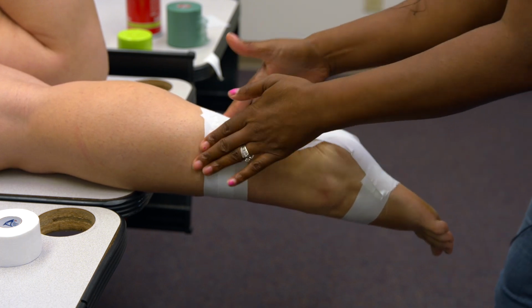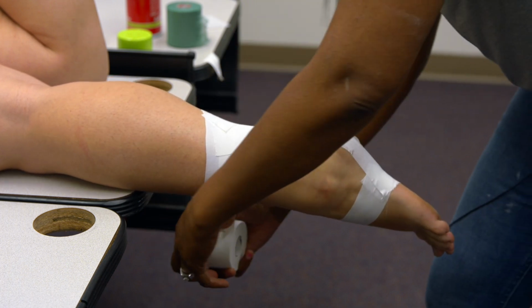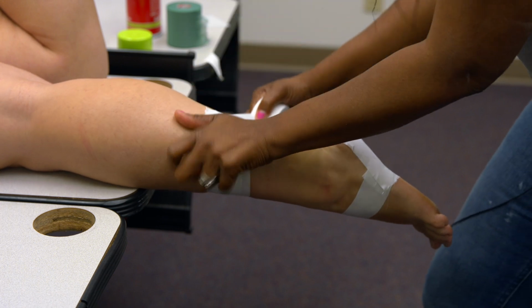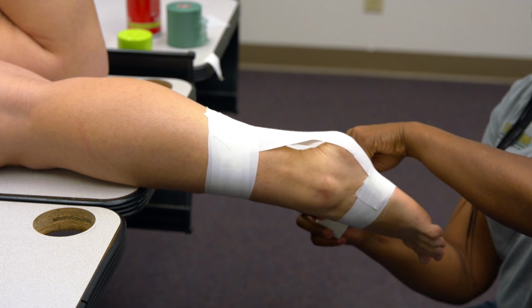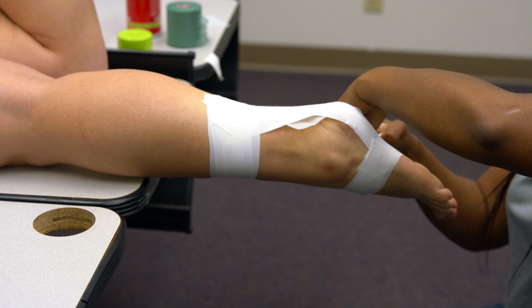Okay, so once we have that down, what we then do is we're going to close that off again with 2 proximal anchor strips. And then we have to close this one off with a distal anchor strip. Otherwise, those pieces would fly up.